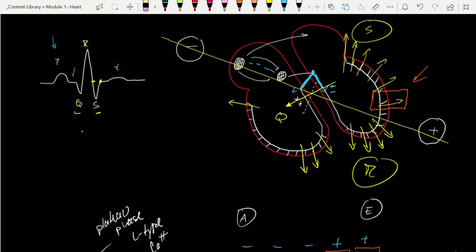All right, so in summary, as we've looked at the electrical conduction pathways of the heart, we identify the P wave as a positive deflection of atrial contraction, as the electrical conduction travels from the SA node to the AV node. Then there's a space given to us by the AV node where everything slows down so that we can wait for the actual physical contraction to happen, right? The electrical stimulus happens first, and then the cells actually do their thing. Okay, now we've delayed.